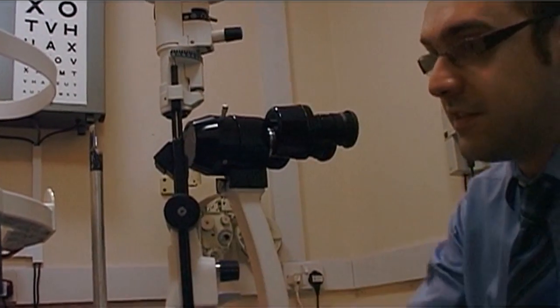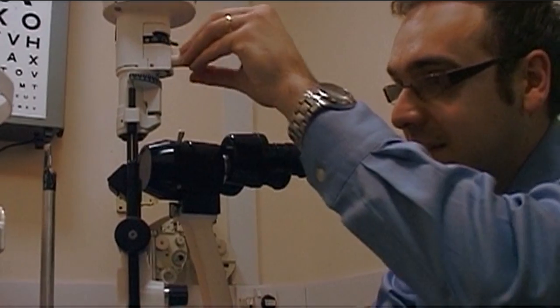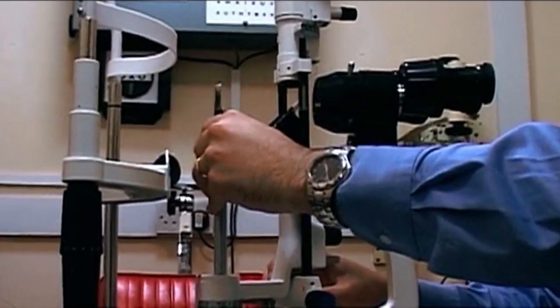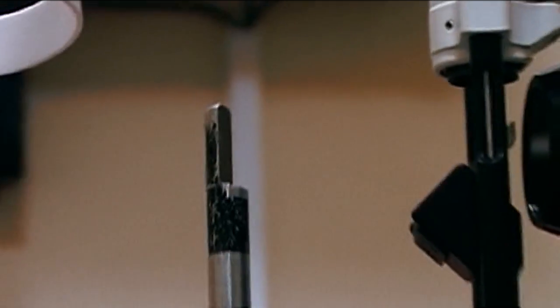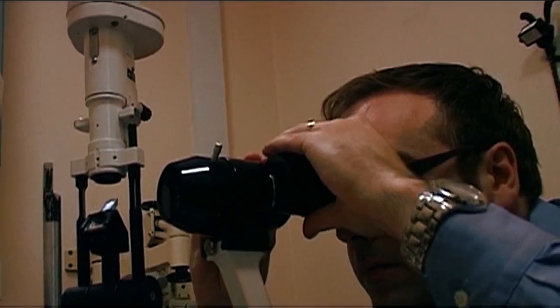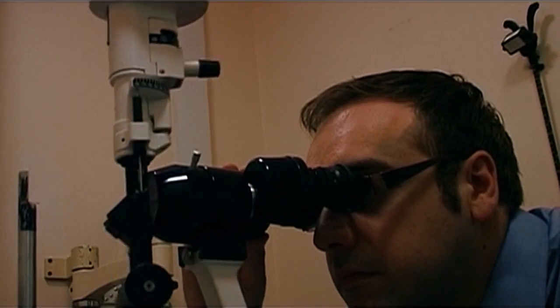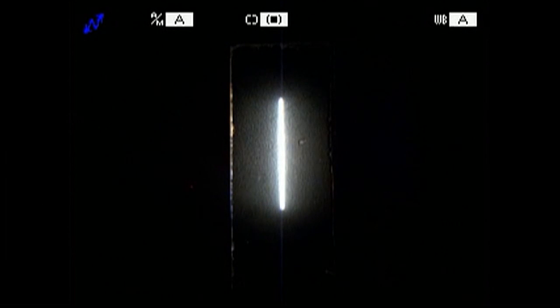As with all slit lamp based techniques, we need to ensure that we correctly focus the slit lamp for ourselves at the start. You may wish to use the slit lamp with or without your correction, usually depending on the level of astigmatism. This includes racking out the eyepieces to the maximum plus and then returning them to the first point of best focus, ensuring we have our correct PD set and using a high magnification, high intensity beam to ensure we get good clear images in both eyes.